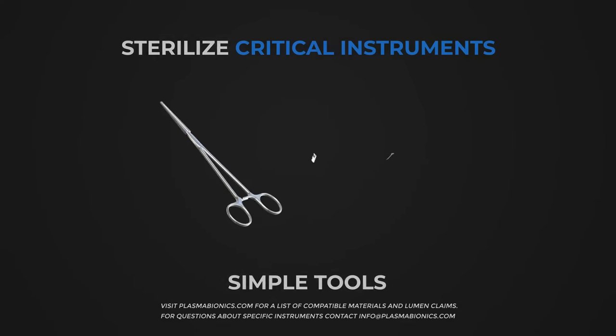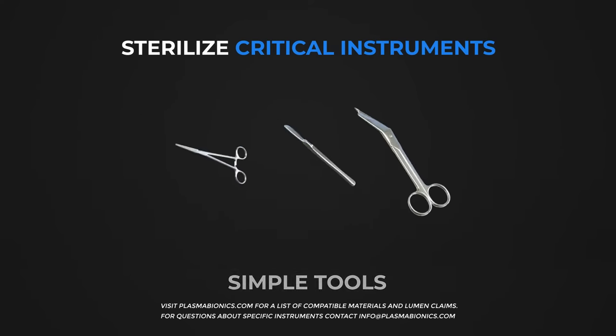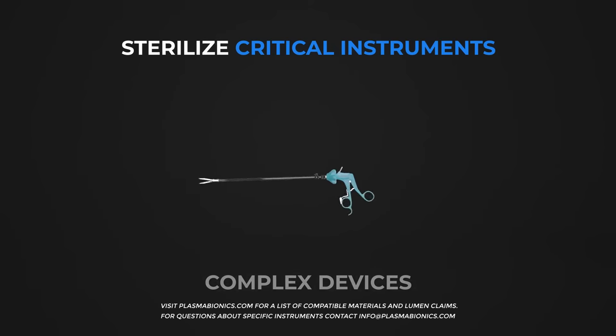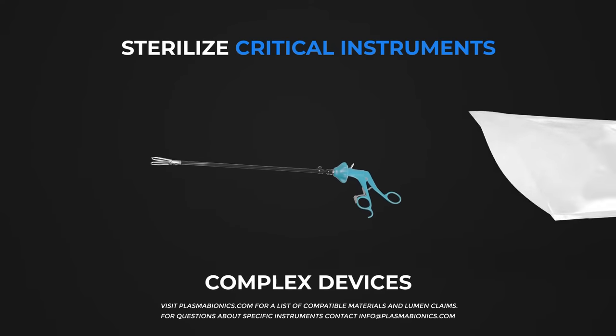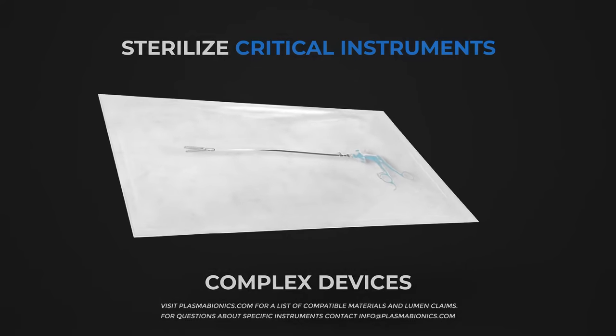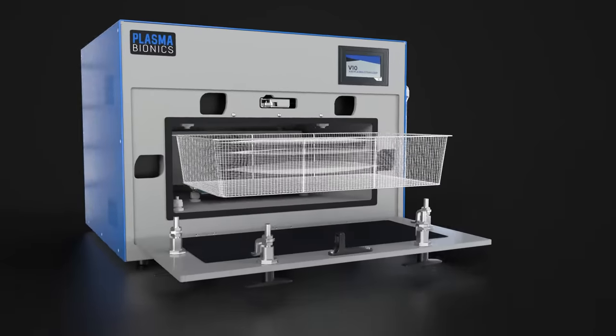Air plasma sterilization can be used on a wide variety of veterinary instruments, from simple stainless steel instruments to complex laparoscopic devices. The process can also extend the usable life of some sensitive instruments, further reducing overhead costs.